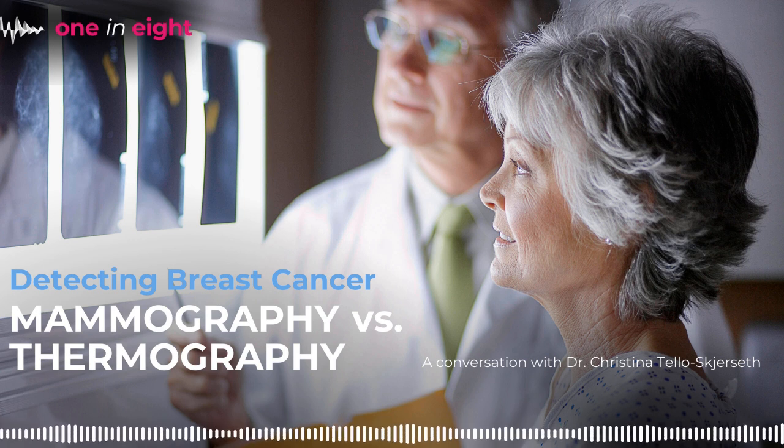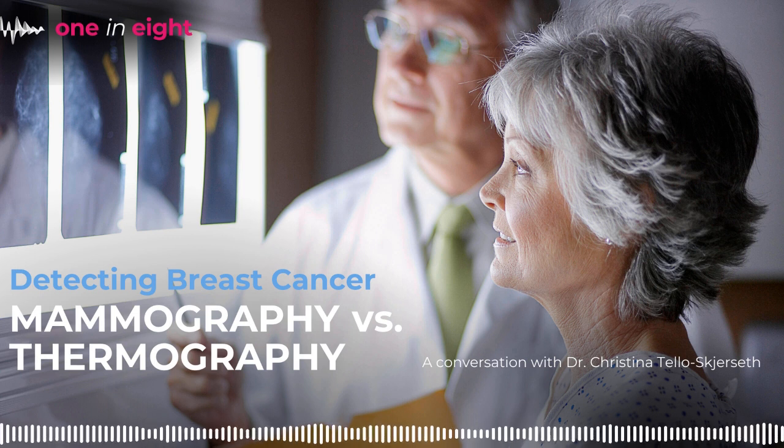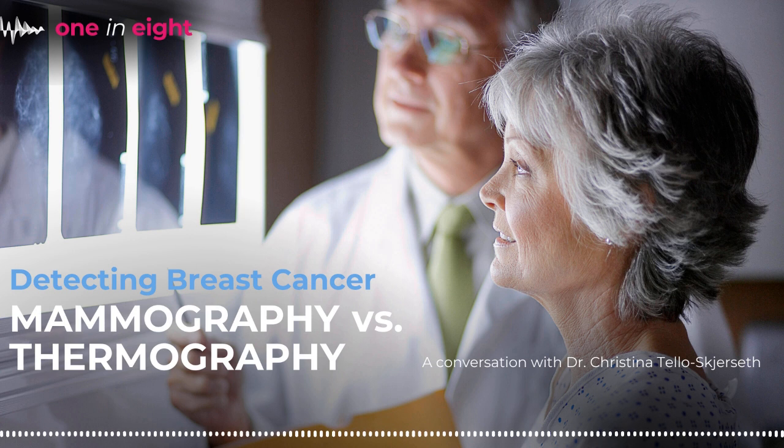And to us living here on Earth, we get cosmic radiation every day, that comes down from the sun, space, everything outside the Earth. So there's a certain dosage that we get every year. And getting a mammogram is about equivalent to just living on Earth for 2 months. It's about that same dose of radiation. So it's very low dose. Our equipment is very technologically advanced. It's very modernized. So we're able to calibrate very well and get the dose as low as reasonably possible. It's very safe. And there's been no data out there showing that mammography causes cancer.